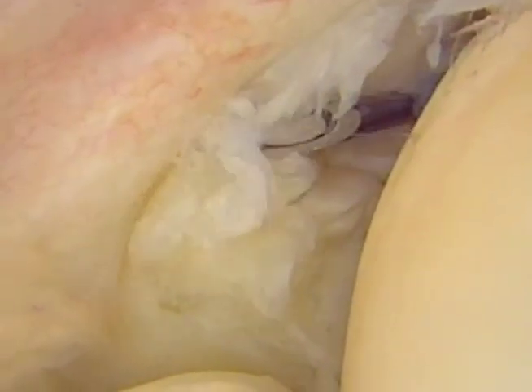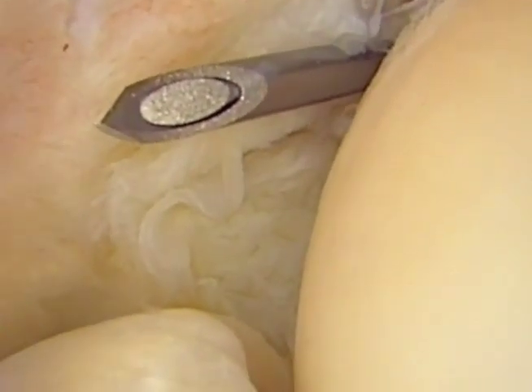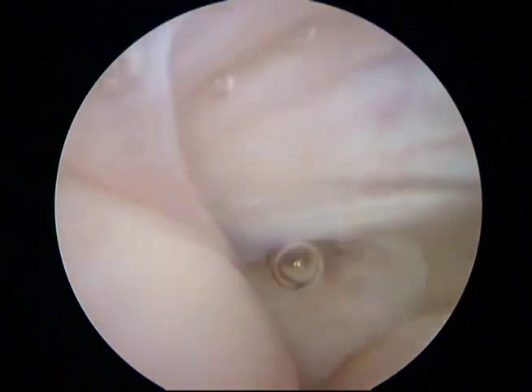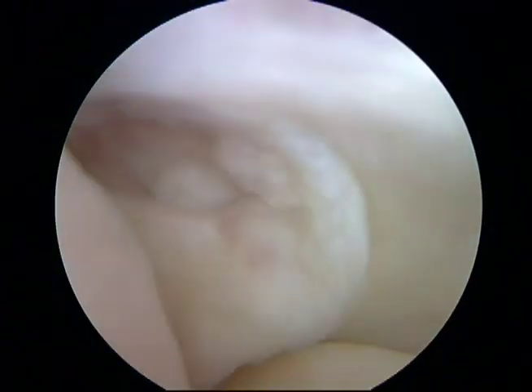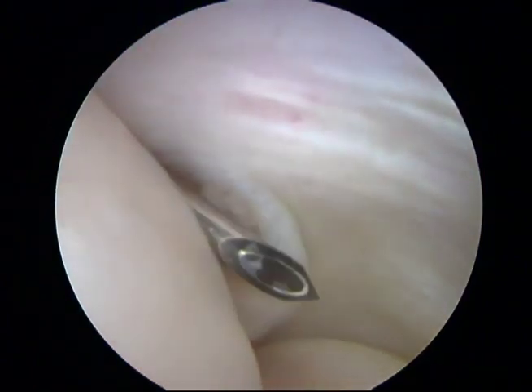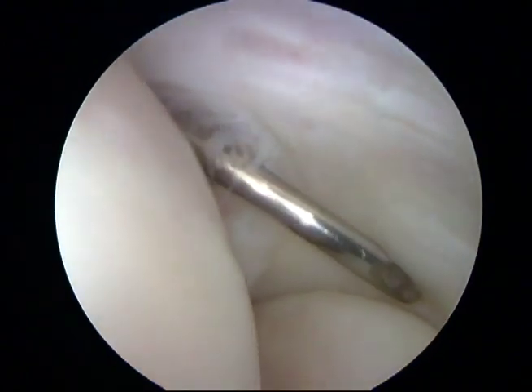In this third example, again a left elbow, note that there's more extensive capsular disruption, but not complete disruption of the capsule. This represents a more extensive version of a type 2 Baker lesion. In this fourth example, a right elbow, note there's complete disruption of the capsule and one can see the extra-articular ECRB tendon through the defect. This represents a type 3 Baker lesion.